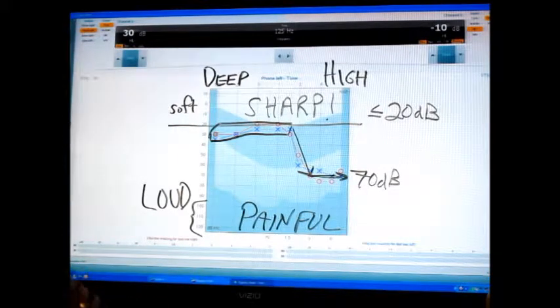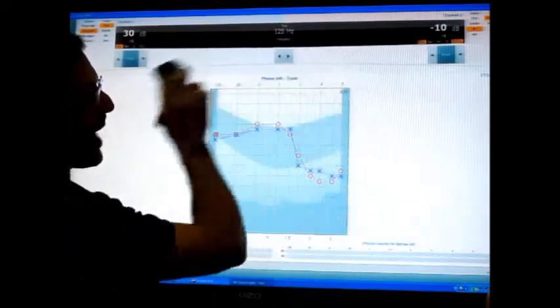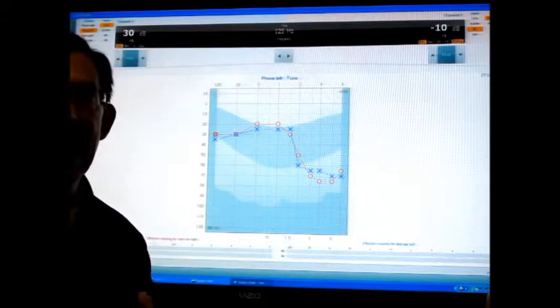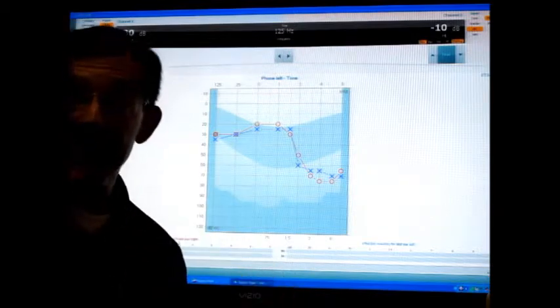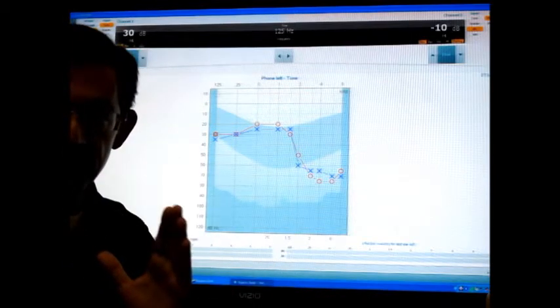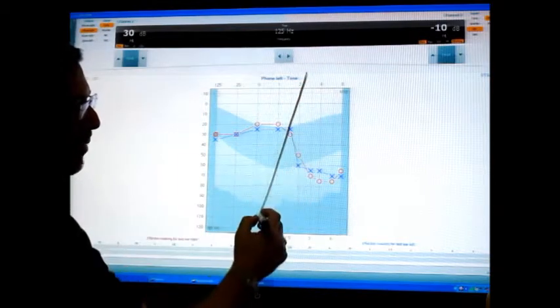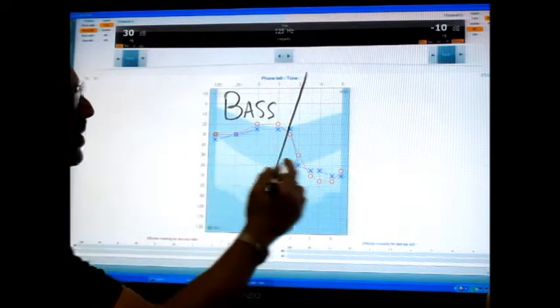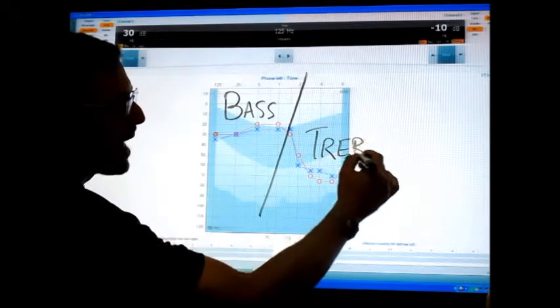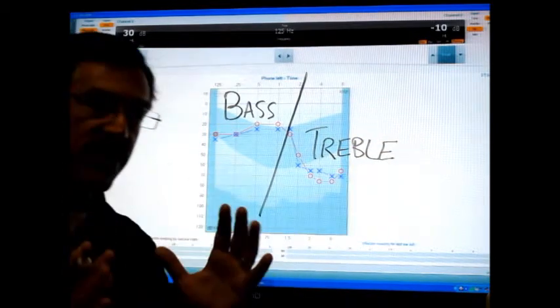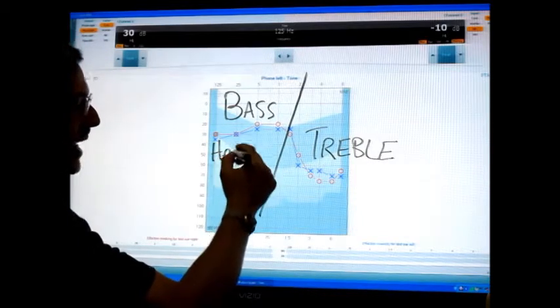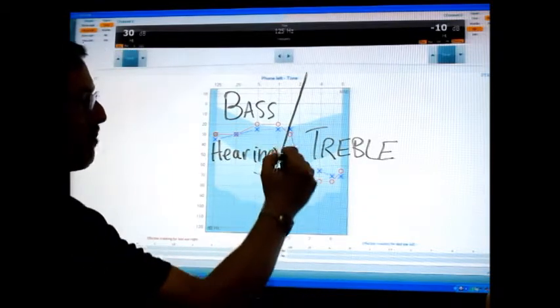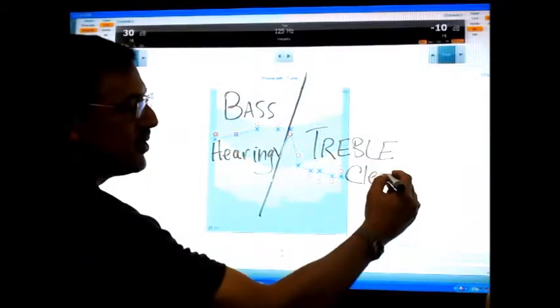Now let's talk a little bit about what that means with what you're hearing, how voices and sounds and clarity are being affected. I'm going to draw a line right down the middle here. These are the bass sounds over here to the left, the lower tones, and over here to the right are the treble sounds.